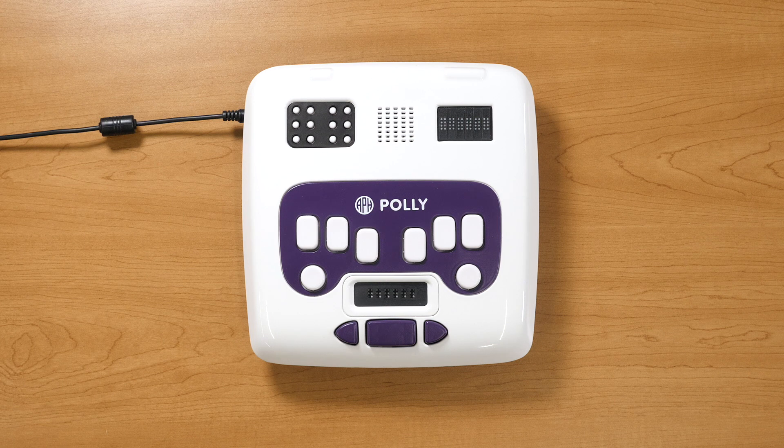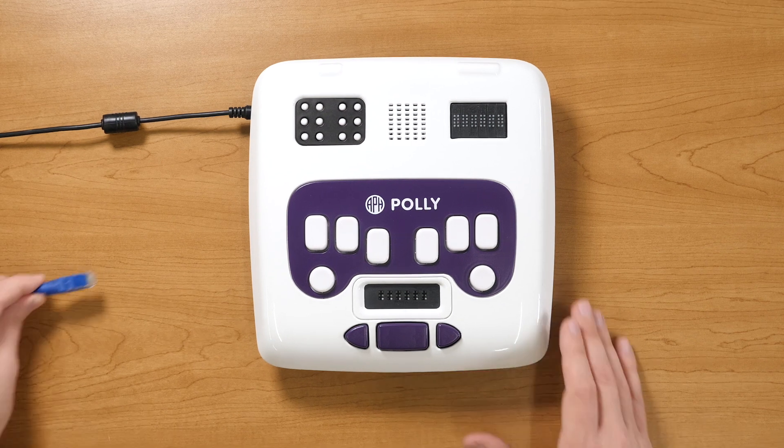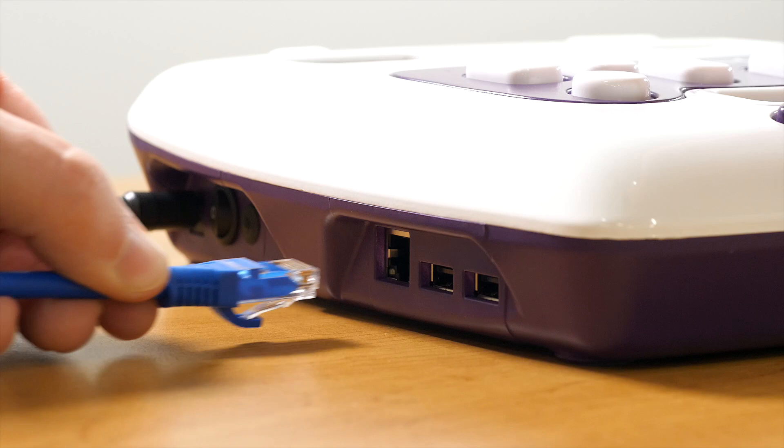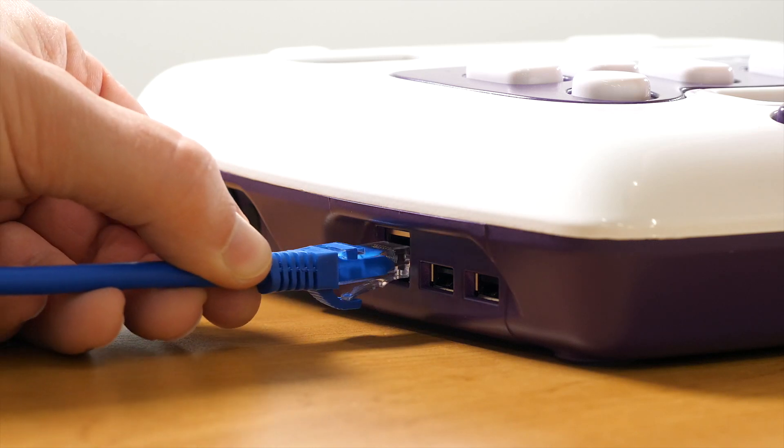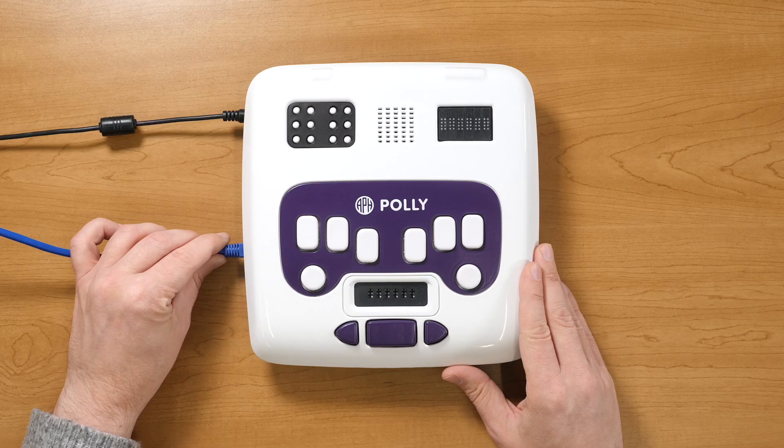The easiest method is via the Ethernet port on the left side of the device. Just plug in an Ethernet cable and your Poly is good to go.